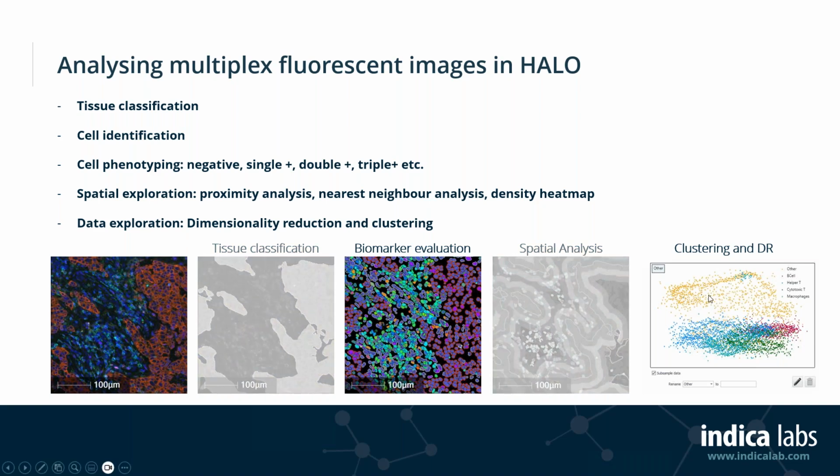During the demo phase of our webinar today, I will mention all the different steps here, but I will mostly focus on the biomarker evaluation phase and touch upon the clustering workflow, as the tissue classifier and the spatial analysis workflows have been described extensively in our past webinars.